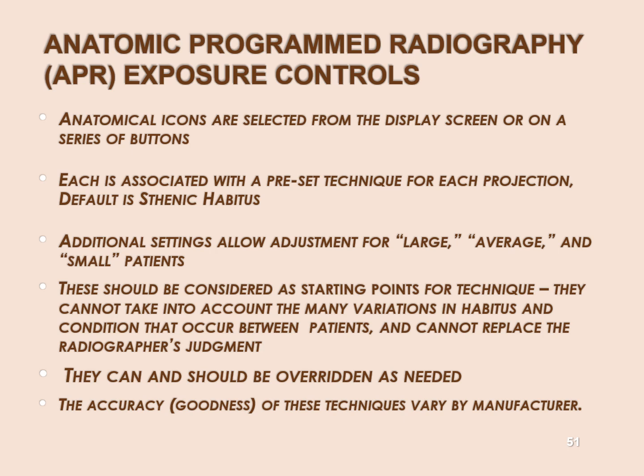All right, so APR, anatomically programmed radiography. You've been using it this whole time. You just don't know what to call it. I don't know why the texts don't call it APR. Texts just say, just tell the machine what you want to use, just dial up, right? But what software is that? That's APR, anatomically programmed radiography.